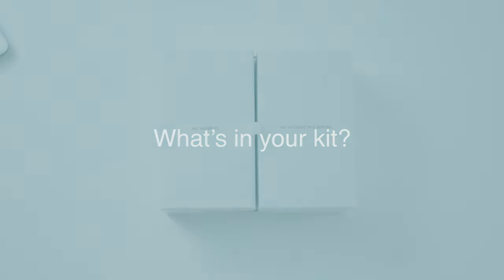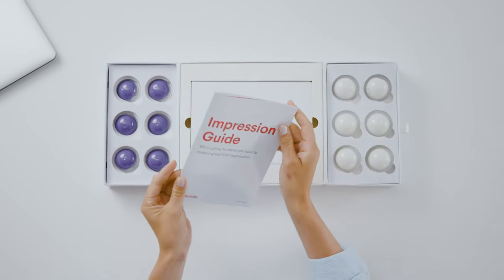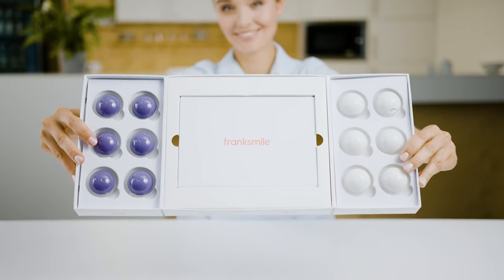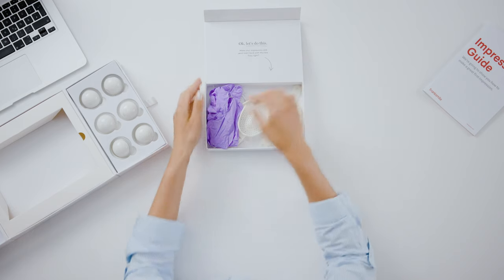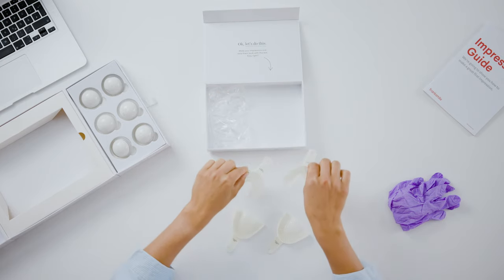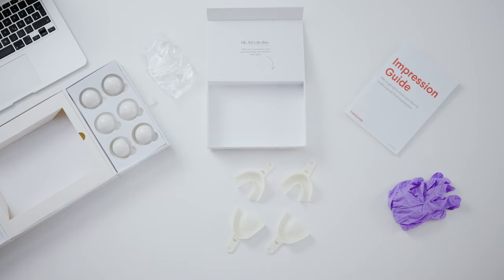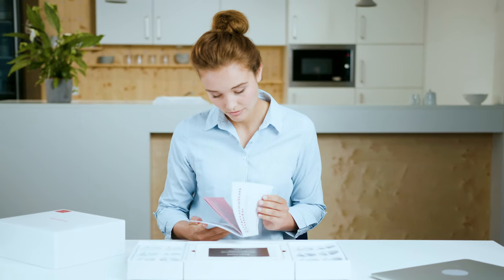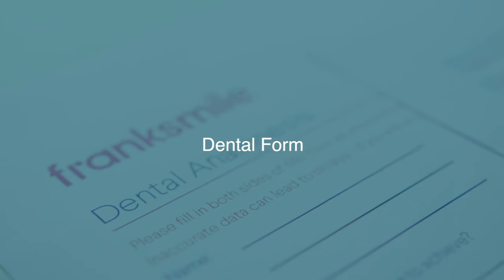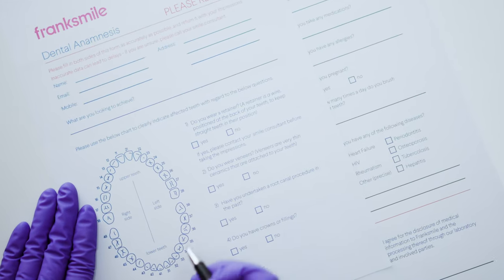The impression kit has everything you'll need to give us your best impressions and photos. Included in the kit are four white and four purple putties, with an extra two sets provided in case you need to redo an impression. Also included are gloves to keep things clean, a total of four impression trays — two upper and two lower — a small stretcher for your photos, and the impression guide. As you work on each impression, be sure to have the corresponding section in your impression guide in front of you. A dental form is also included in your kit, which will need to be filled out completely before sending your impressions back to us.